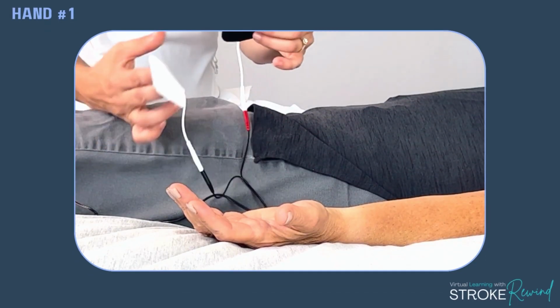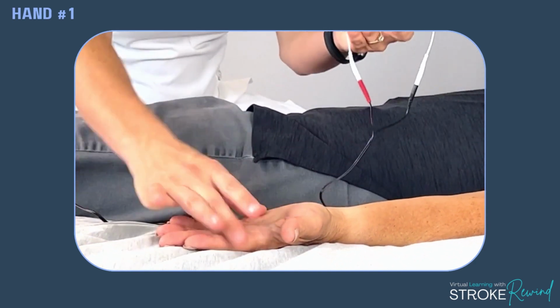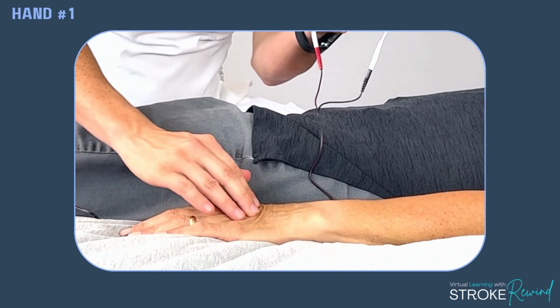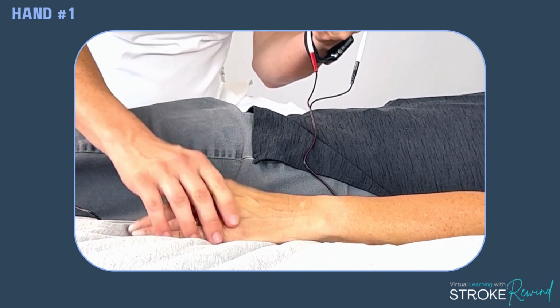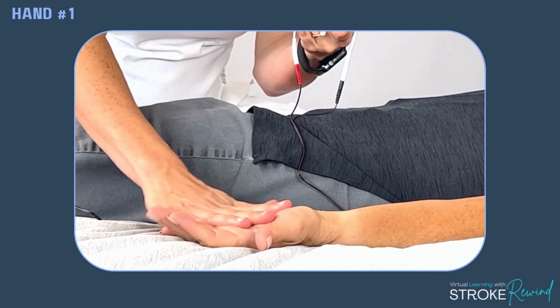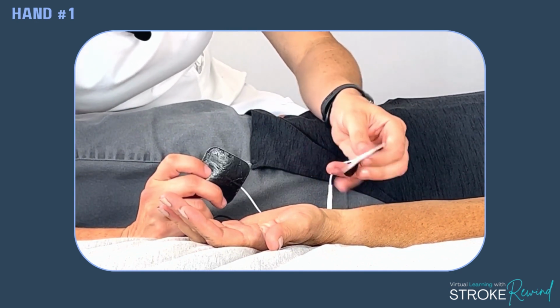Let's talk about electrode placement for the hand. So again, the hand, you never want to do the back of the hand because it's too bony. And so if you remember, anytime I talk about electrode placement, I'm always saying find some meaty, fatty part of the arm or the hand. So for this, you can actually do different areas. So I'll just show you an example.